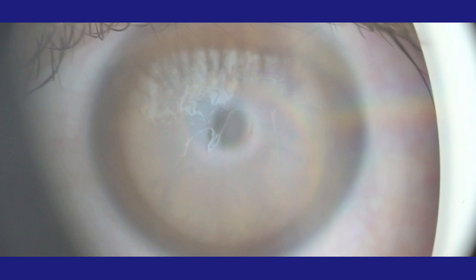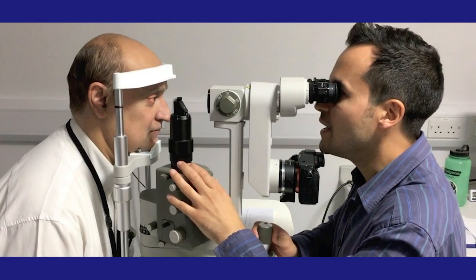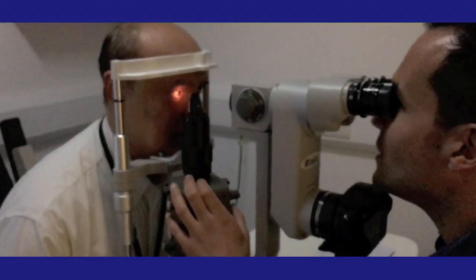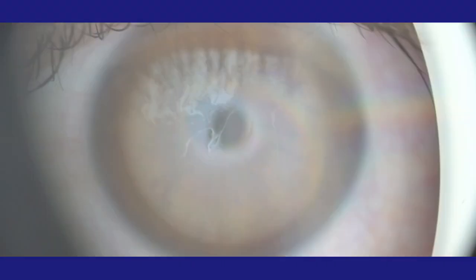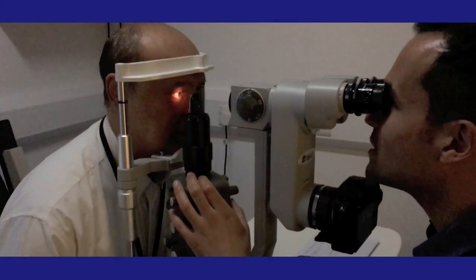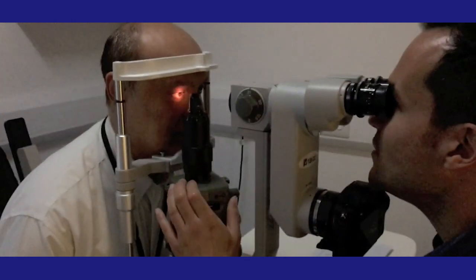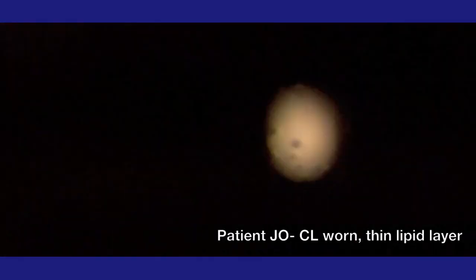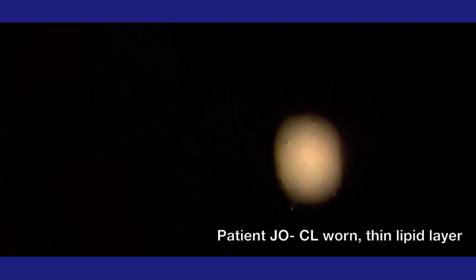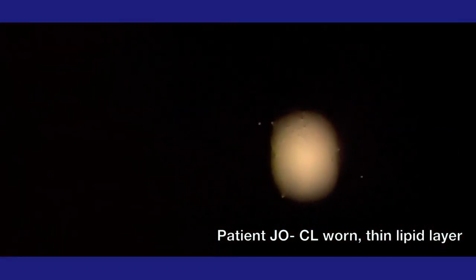Well, that's fine to do this with a device like a tear scope, but in fact we can do this with a slit lamp in normal practice. You don't need a tear scope, but I think this is something that's helpful to do at contact lens aftercare examination. What we have here is the slit lamp at high magnification, maybe 30 or 40 times. We have a narrow and a very short slit beam. But you can see here on the same patient, we're getting the same patterns now when we look into the bright reflection of this slit lamp beam into the slit lamp viewing system itself.